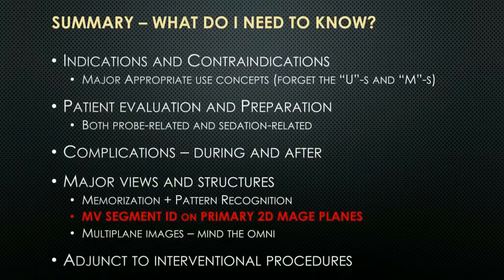While Dr. Cronson makes it up to the podium, there were a number of questions on scallop identification. I have two comments about that. One, hold on to those questions until after Dr. Mankad's lecture, and Marty will be around also. I think between the two lectures those questions should be cleared up. I also think that in this age of omniplane and 3D, a lot of the scallop identification that you need clinically is really a moot point, because especially if you use your biplane imaging, you pretty much can nail the affected scallop. The questions I did want to ask you, Marty, were procedural.